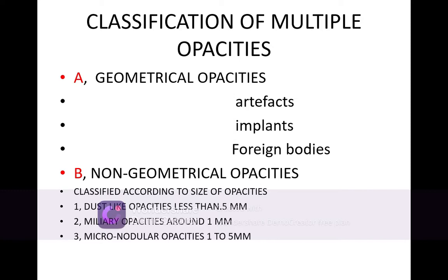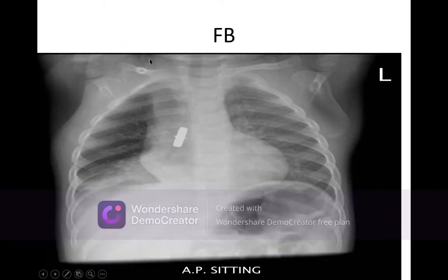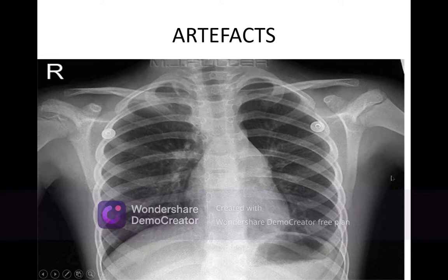Now, the other one is a single foreign body. This is entrapped outside the pleura, but in the chest wall. This is a bullet, which is seen here. Although it is one, it may be 2 or 3 pellets. The gunshots may be entangled opacities here. It's possibly on the soft tissue shadows. Around here it is possible. I have seen it here also previously.